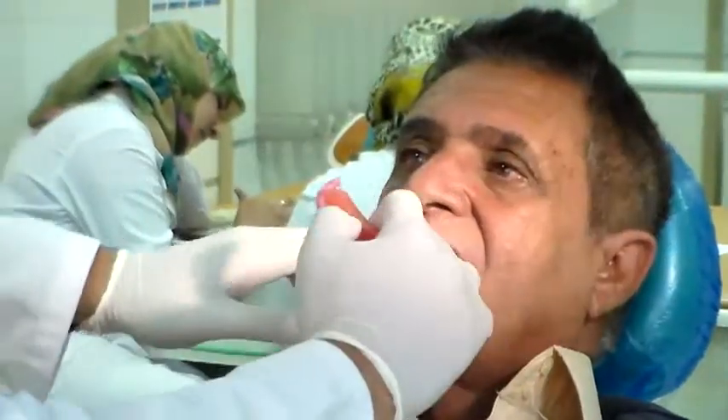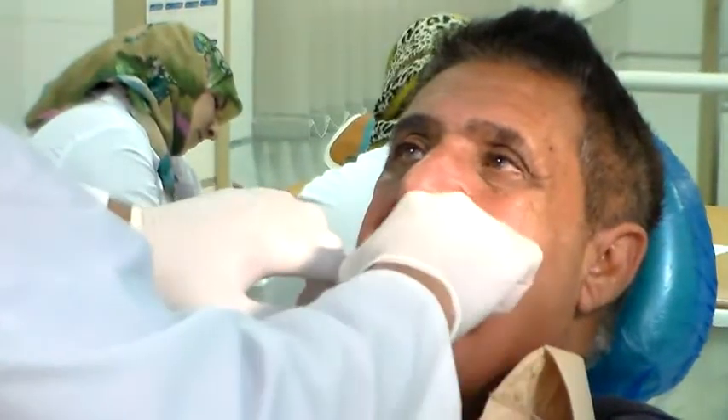Having gotten this, we are now going to go in with our lower occlusal rim, raising it into position.